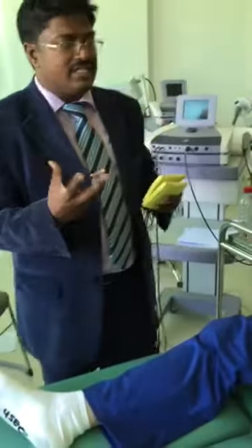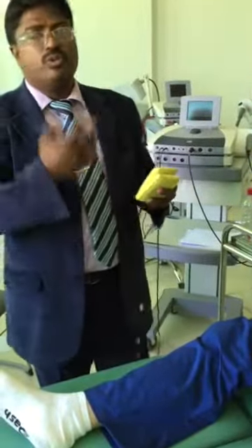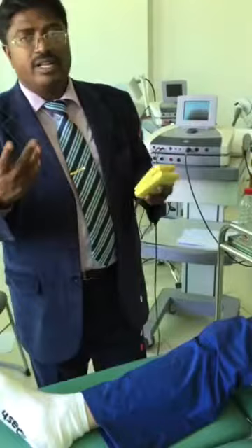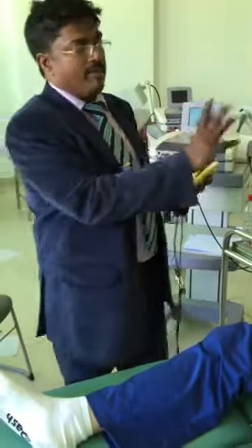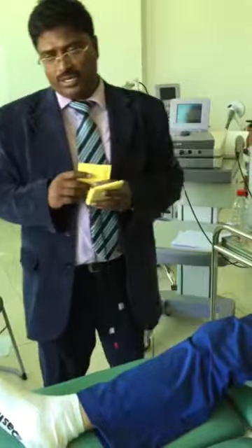These are the areas where each particular nerve is superficial. Whenever a nerve is the source of the problem, you keep the electrodes wherever that nerve is superficial, depending on which nerve is involved.